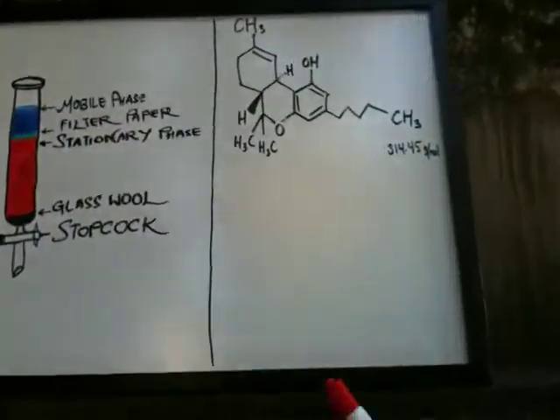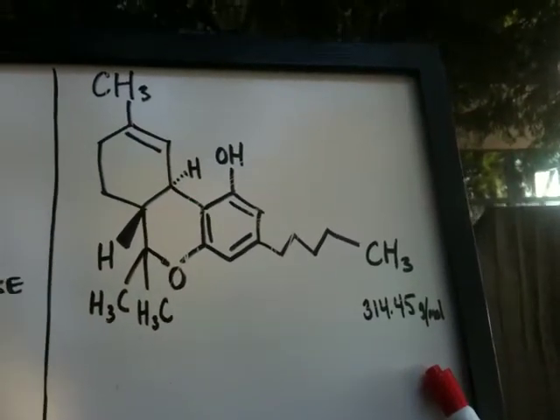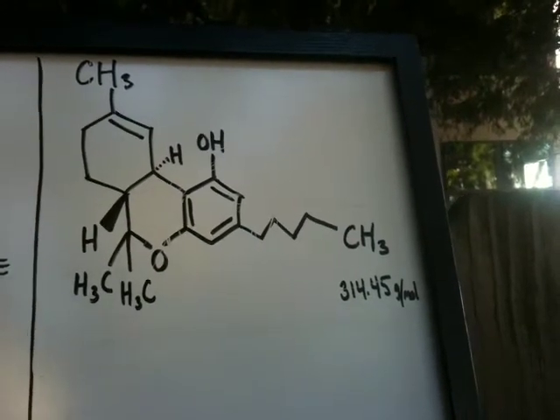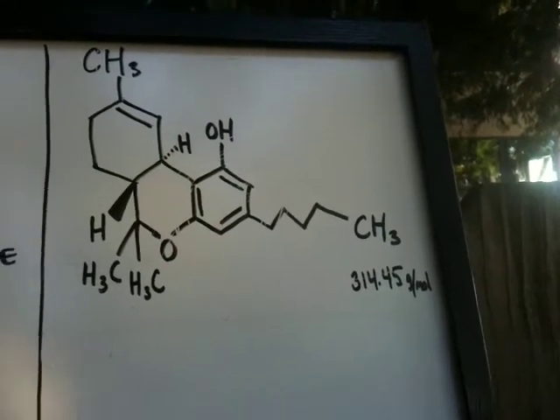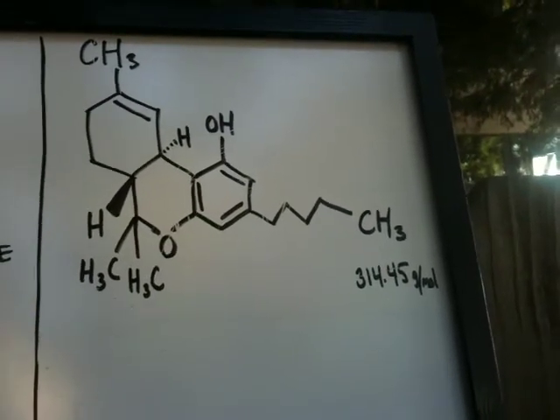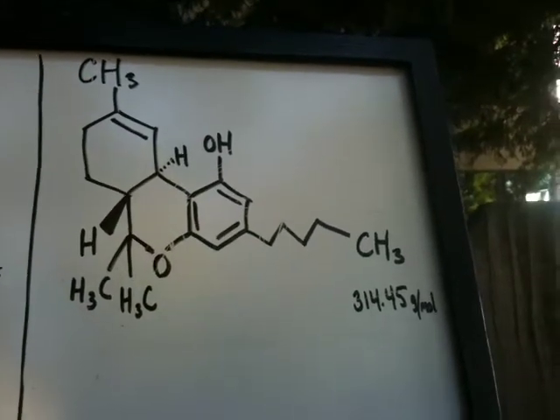If you had been taking drugs, for example, marijuana, the active ingredient called tetrahydrocannabinol, or THC, would absorb into your system and be detectable through LCMS. THC is not very soluble in water, but is in organic solvents because THC is primarily nonpolar, and it would have a low affinity for the stationary phase.